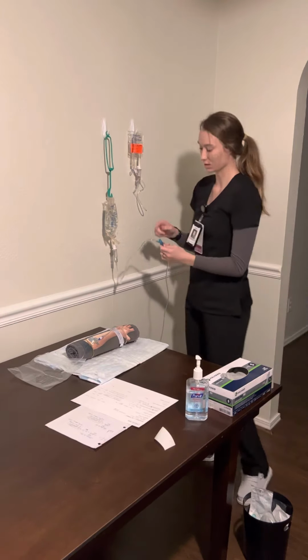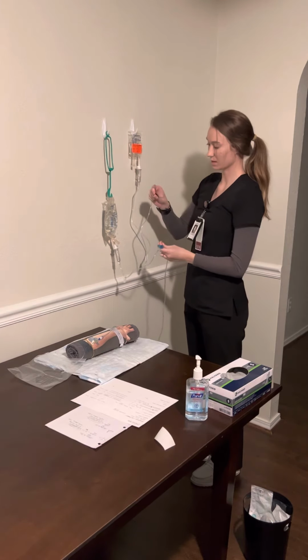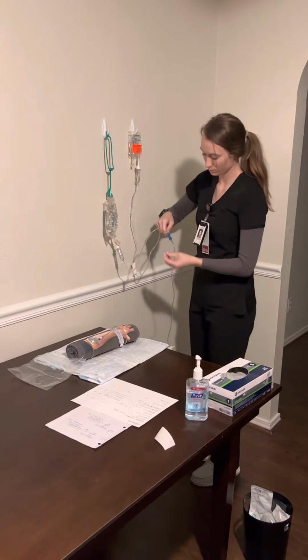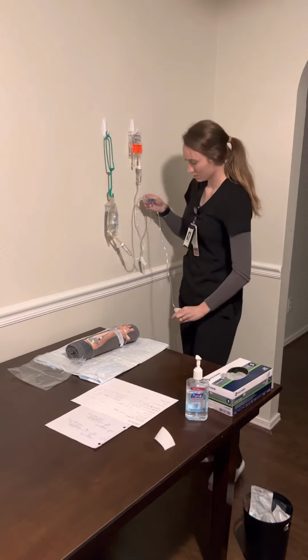Same as the arm, I'm not going to let that touch anything because I just cleaned it. We're going to remove this cap from this tubing and connect the two. Okay, clamping the normal saline so that this doesn't run.